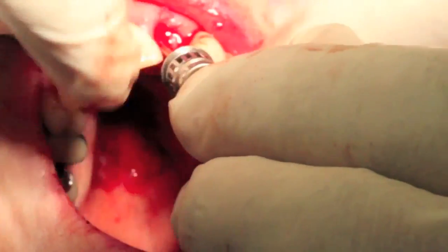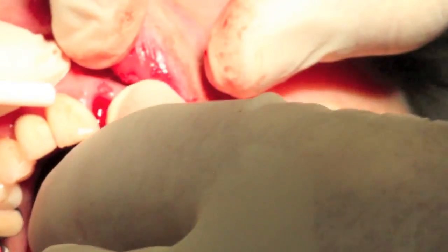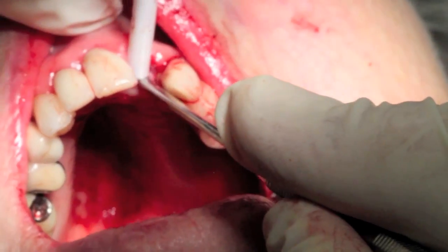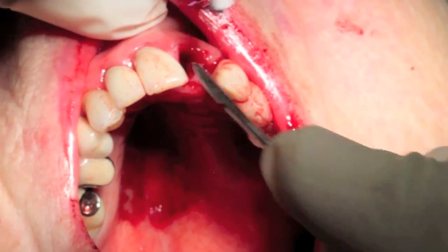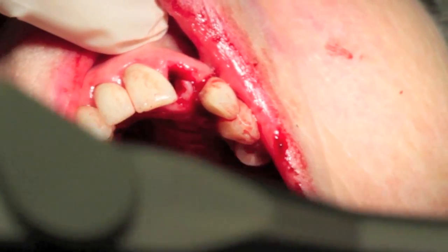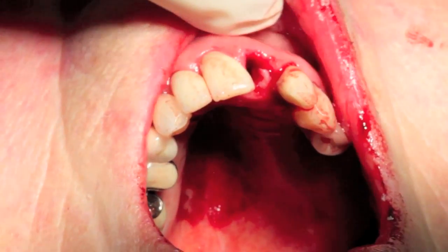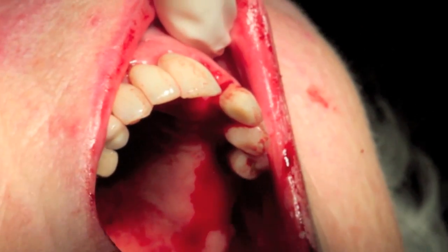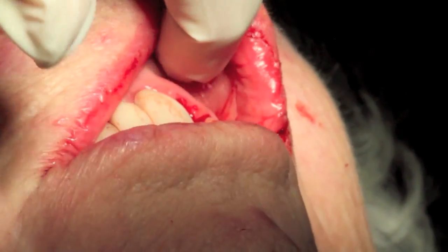So here we're placing the allograft, and then we're going to take that cover screw back out so that we're able to then put on our immediate temporary abutment. It just gives a little bit more room to use the cover screw, but the abutment could be placed. We just don't want the bone graft going inside of the implant and filling it up, and having a problem when you go to put on other abutments later on.